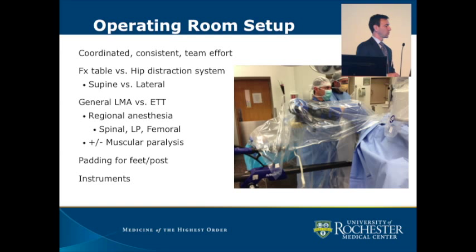I usually don't use an anterior portal unless there's some kind of additional suture shuttling that needs to be managed. I use a modified or mid-anterior portal and a distal anterolateral accessory portal for peritrochanteric work. If you get into trouble early on and you're not getting good visualization, and you get in there and everything's red, you can establish a posterolateral portal for outflow, and that'll clear things up easily. It's a good trick for that.